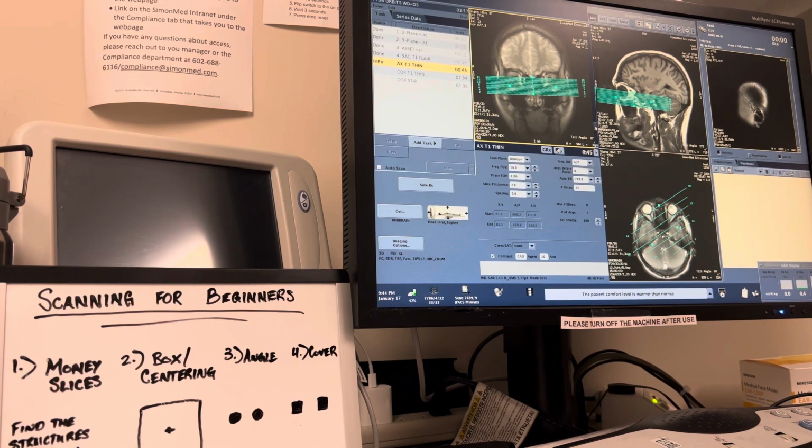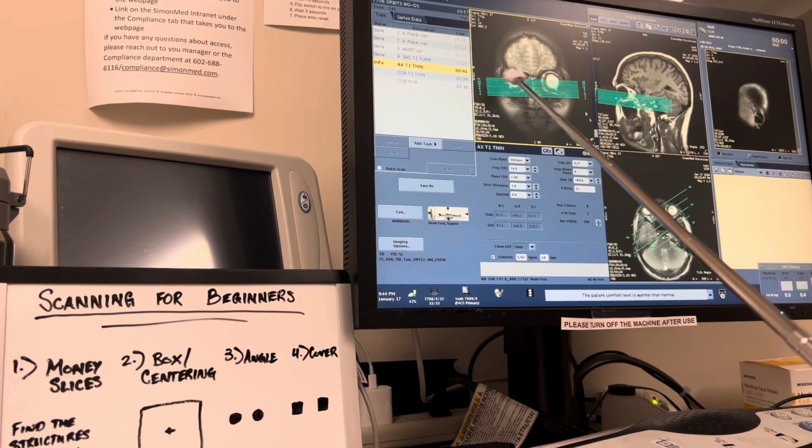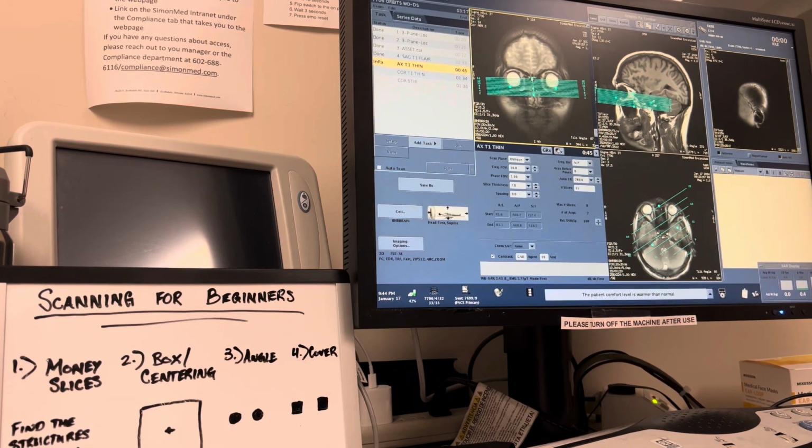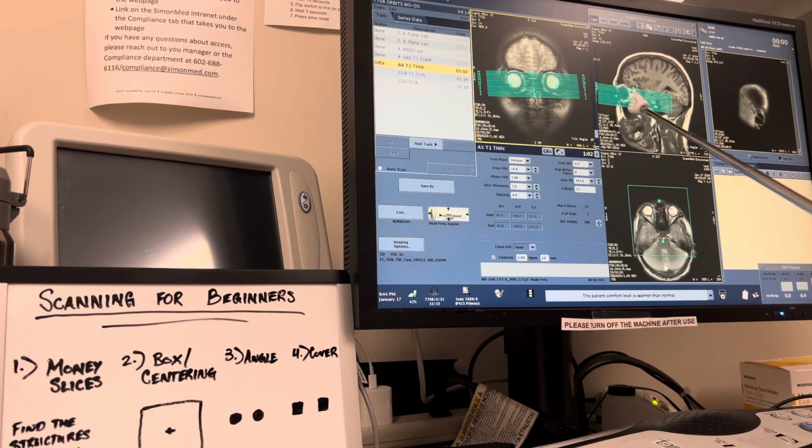So let's go down one. There you go. Let's add those back and see if that top line is pretty close to the top of both. Yeah, there you go. Okay, looks pretty good. Now we're going to come over here and angle with that optic nerve. The reason you only see one little dot is because optic nerves are like this, right?